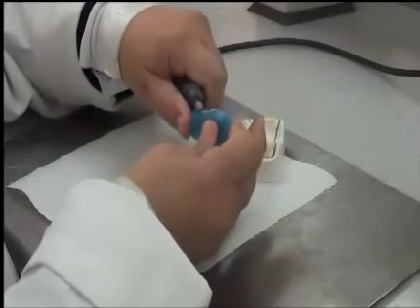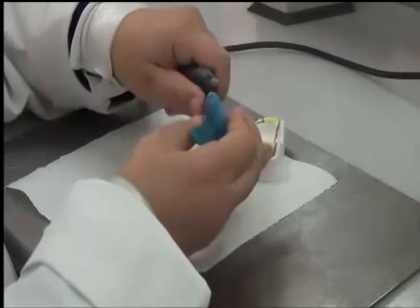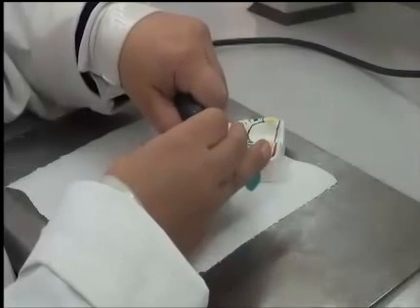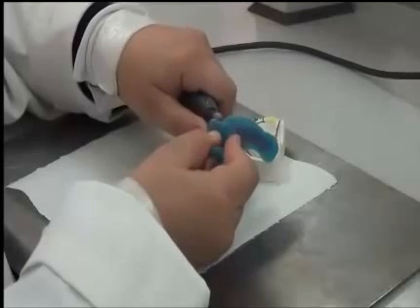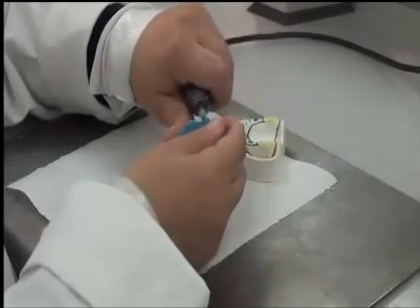Further smoothing the surface, going around the borders on the upper side, going into this notch and smoothing this, and making sure that all of the edges are not sharp.